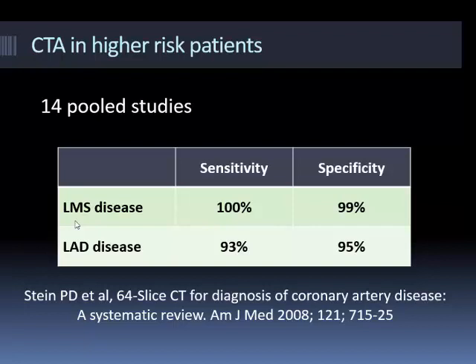And obviously, for looking at left main stem and proximal LAD, because these vessels are larger, it means it's technically easier to interpret. As vessels get smaller and smaller, because of the limited spatial resolution of CT, remember your CT resolution is 0.5 millimeters at best. Often you're reconstructing at thicker slices, and because of problems from artifact from calcium, it makes it more challenging. You will often, as I say, overestimate stenosis in comparison to higher spatial resolution techniques such as angiography.